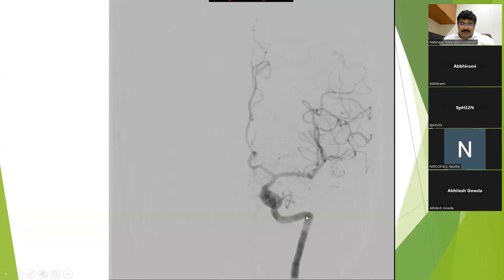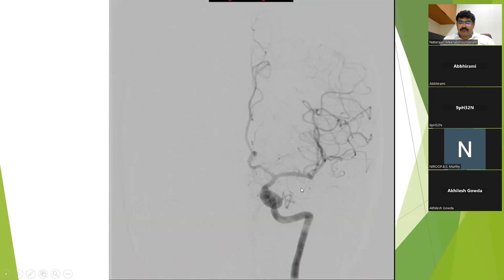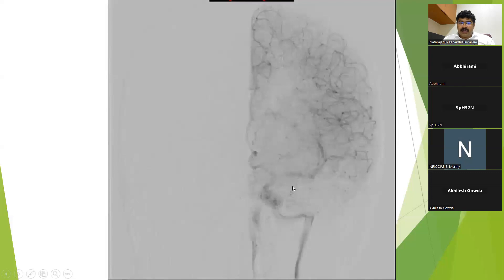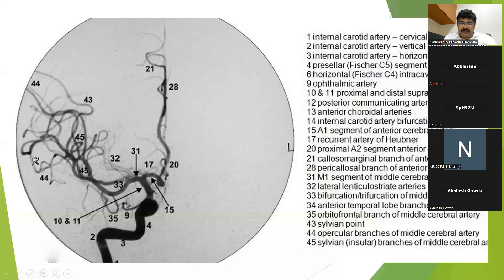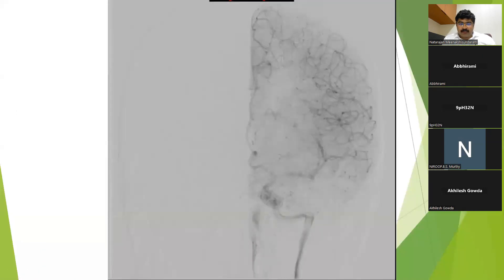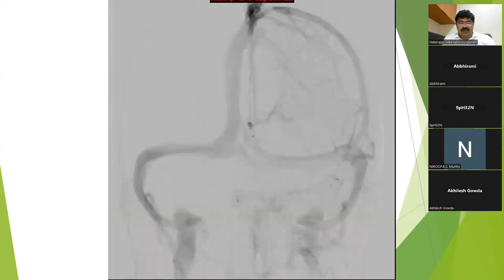In the angiographic picture, this is the cervical ICA, then the Petrous ICA, then the horizontal and then the Cavernous ICA, and then the ICA bifurcation into the anterior cerebral artery and the middle cerebral artery. This is the A1-ACA, this is the M1-MCA. This is the arterial phase.